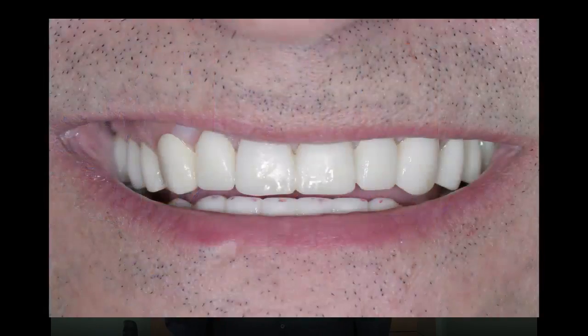And here's the Diagnostic Wax Up. And if you've been to my seminars, you know how we take the Wax Up and create shells and make the provisionals to mimic the Wax Up. And there's a lot of ways to do that. And actually, I tried a new way for this case. So I'm going to share that with you in a future seminar.